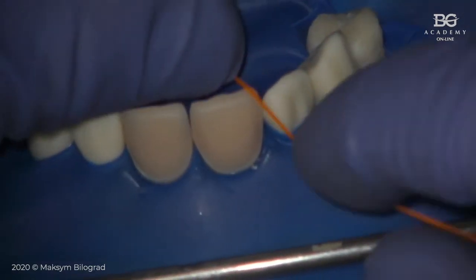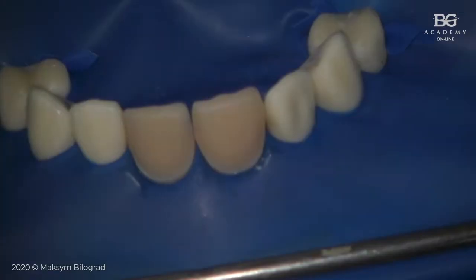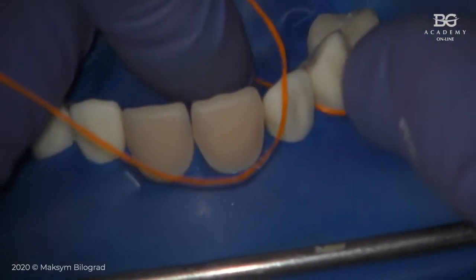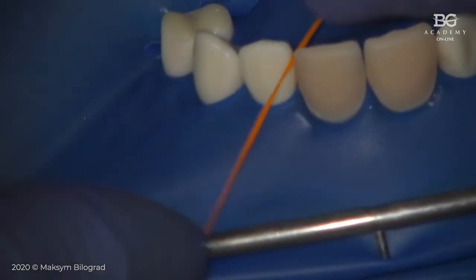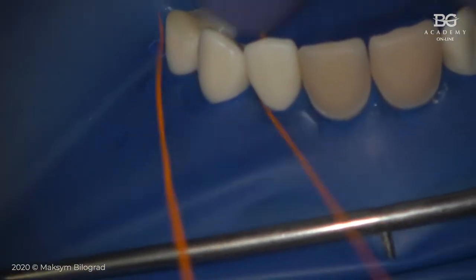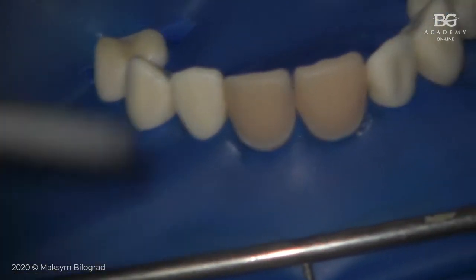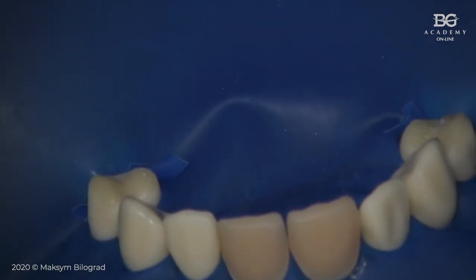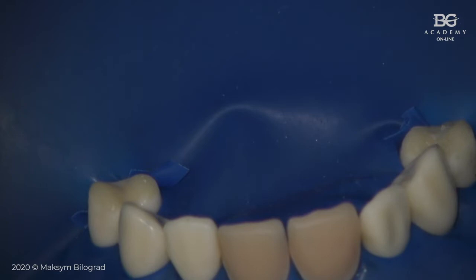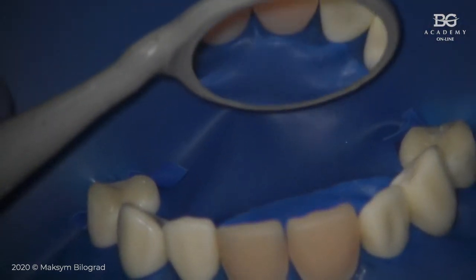You can use a plastic instrument or spatula or probe to invert your rubber dam, but personally I prefer this method with floss. It is more efficient. And once you're done, don't forget to take a mirror and check if you have proper inversion from the palatal side. Because if you make a really good inversion from the buccal side, but from the palatal side the inversion is not complete, it's bad rubber dam isolation.